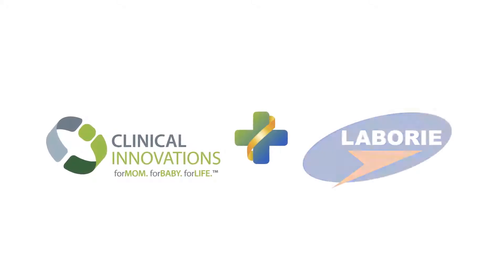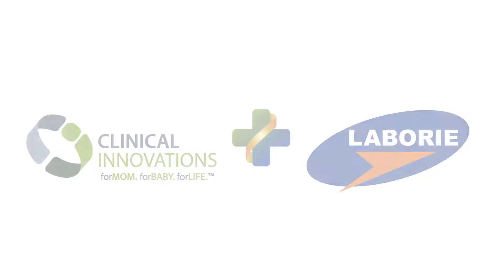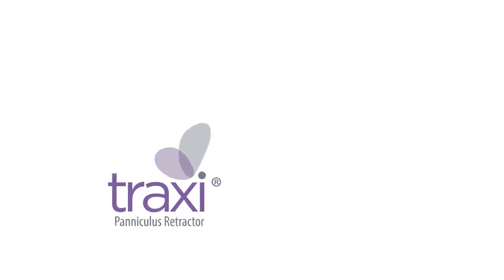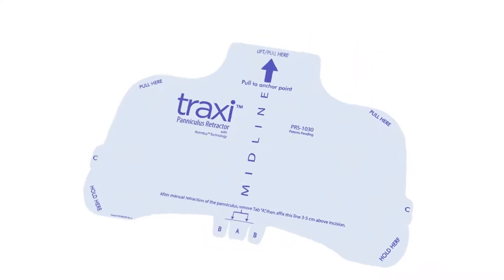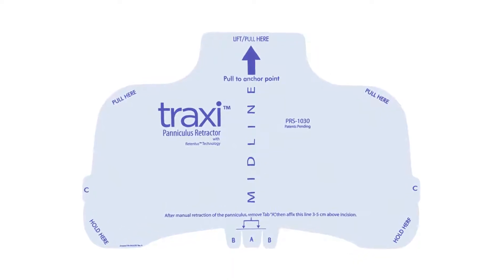Clinical Innovations is a division of Laborie Medical and is focused on the care of mothers and babies. The Traxi Panniculus Retractor provides a simple solution to a big dilemma. Traxi is designed with the patient and healthcare practitioner in mind, and quickly and easily retracts the panniculus in high body mass index patients during any abdominal procedure. Applying the Traxi retractor can be achieved in just five simple steps.